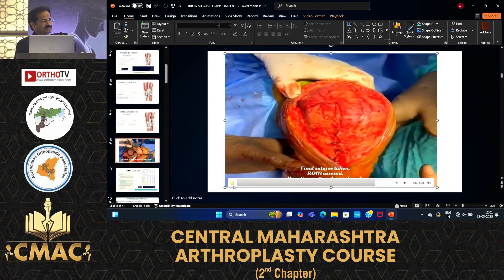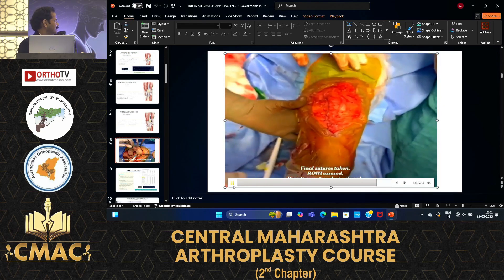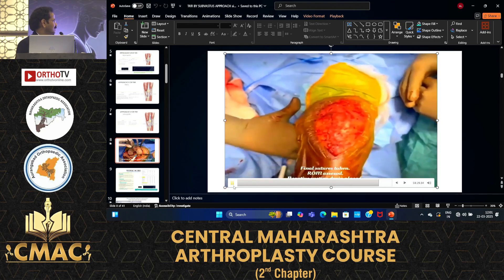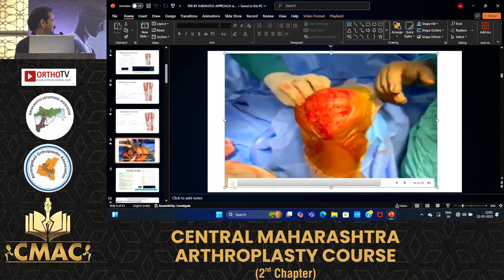The extensor mechanism is restored. Excellent — excellent live recorded demo.